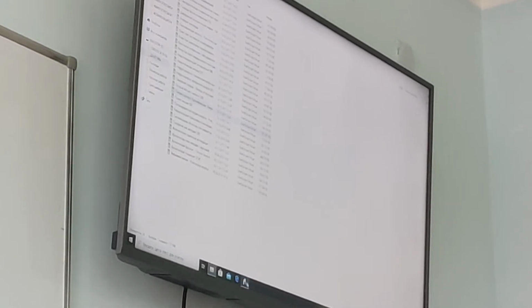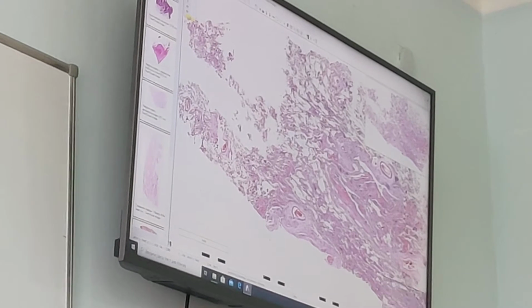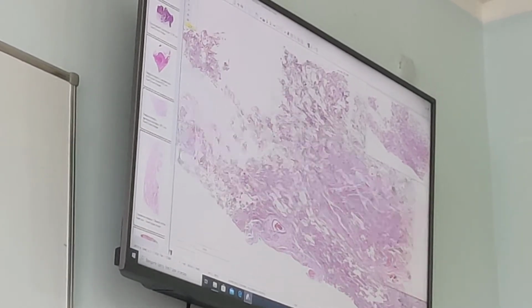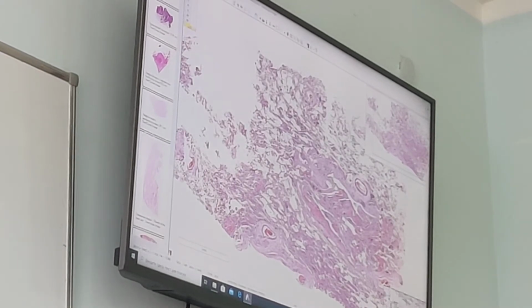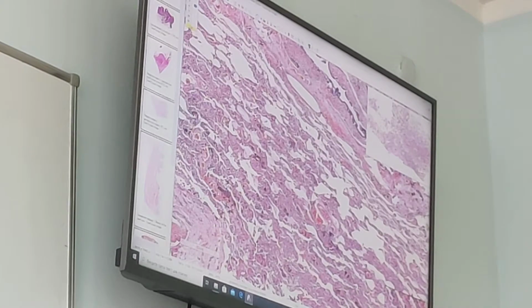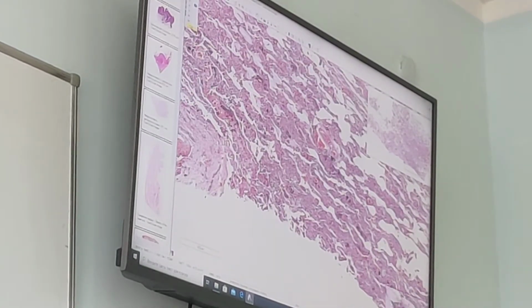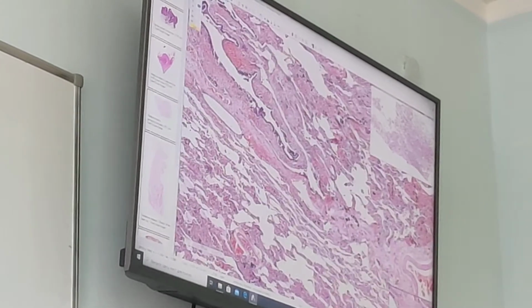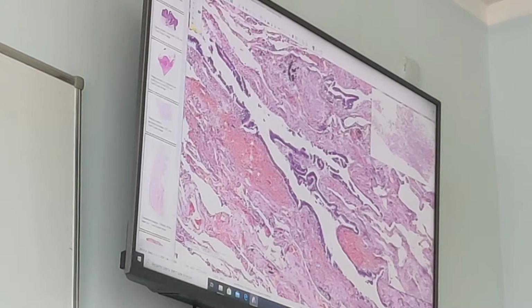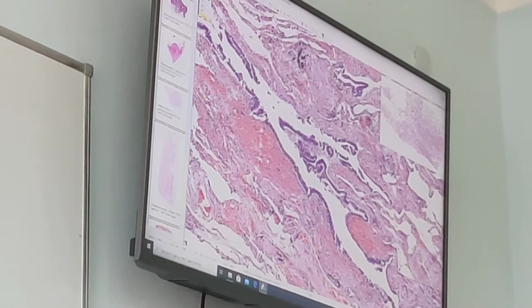Next one, preparation with few pathologies in one place: focal purulent pneumonia, pneumosclerosis, and carnification and emphysema. Foci of bronchopneumonia were the reason for all subsequent changes. Foci of bronchopneumonia are located there. Outside the bronchi, in the wall of bronchi, also some inflammatory cells can be detected. Purulent bronchopneumonia means neutrophils plus macrophages.